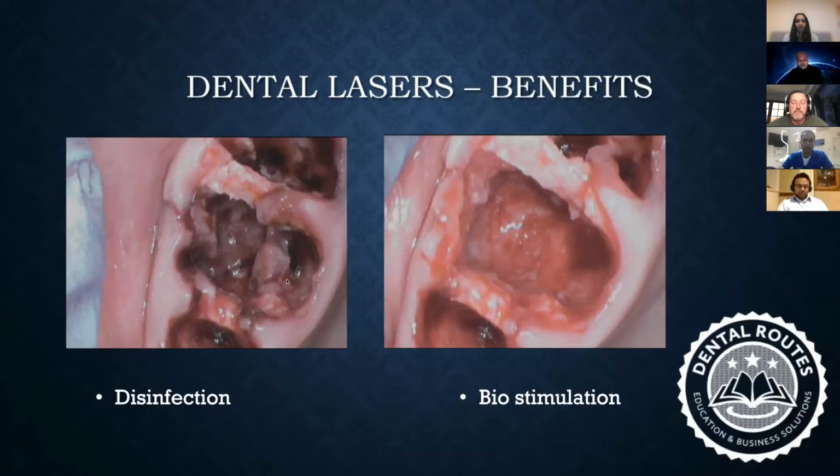And the second aspect, which makes my life so easy and so predictable, is what you can see in the picture, where you have granulation tissue when you have taken a tooth out. You have infected sites every time you want to place an implant. And traditionally, what was my approach? I used to consistently try to scrape it out as much as possible, leave the body to take its course to heal and disinfect it, and then come back to see how I can place an implant.